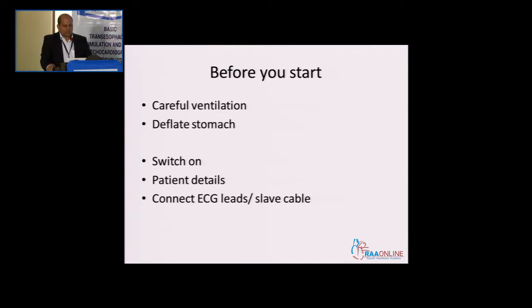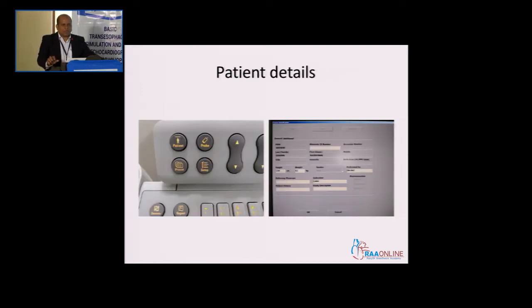When you switch on the machine, that's when your work starts. Your assistant can switch it on. It's very important to put the patient details, and it's extremely important to have the ECG cables, ECG. You would have seen the previous speakers, all their images had ECG. If you are writing the FIACTA exam or EACTA European exam, it's very important to have ECG in all the logbook cases you submit. It will help you to do the calculations better.